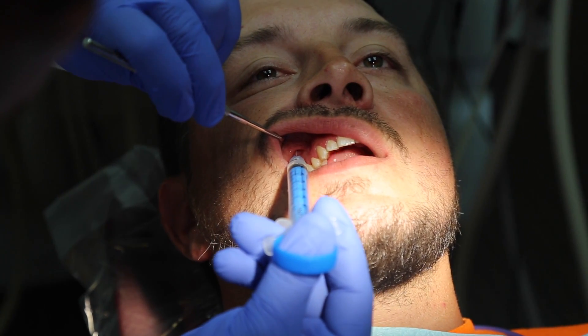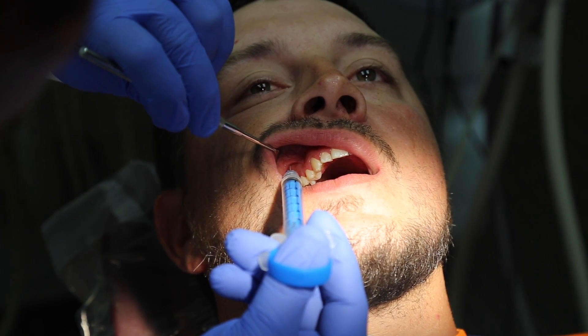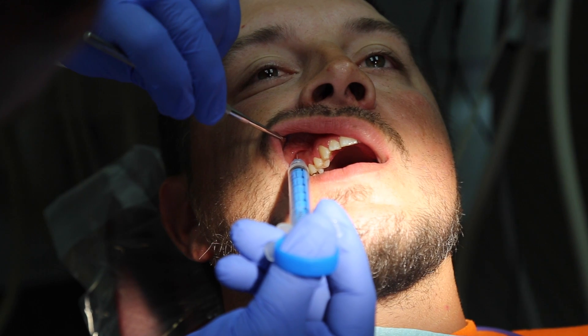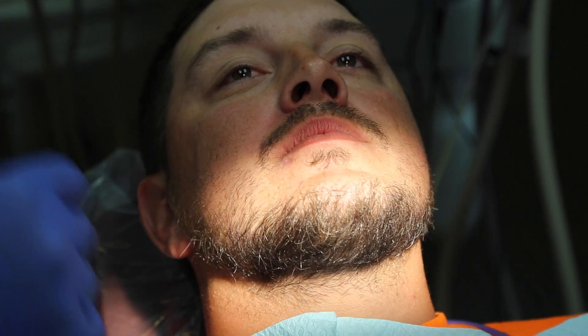How are you doing, Ed? Good, no troubles? That's it — rinse that out.